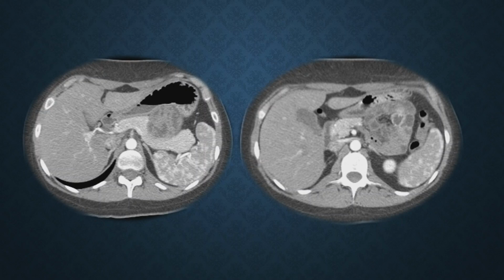So we have the images of the contrast enhanced CT. We see the liver with no apparent lesions. We see the spleen, pancreas, and we focus our attention on the stomach and the pancreas. In between them, we see a heterogenic mass, and in the lower image, we see that the mass corresponds to a small bowel between the pancreas and the stomach.